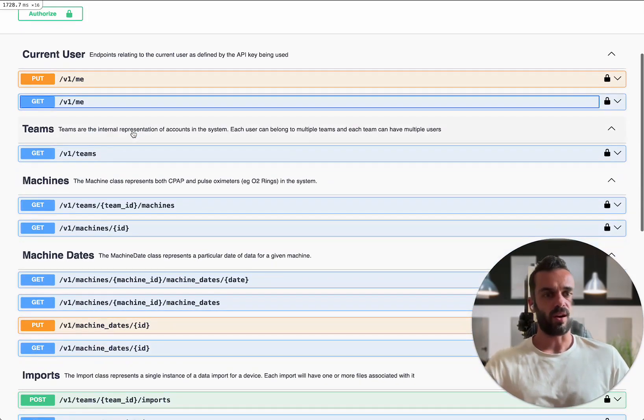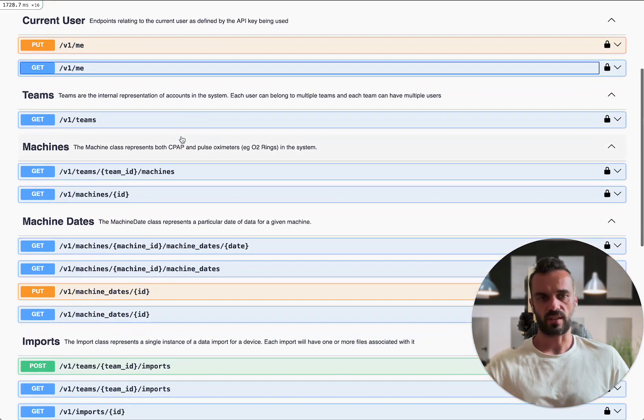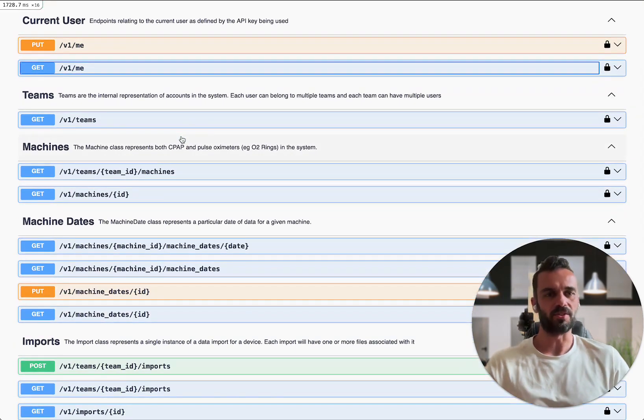Once you're in there and you're doing that the really interesting stuff is then going to be actually interacting with the data.